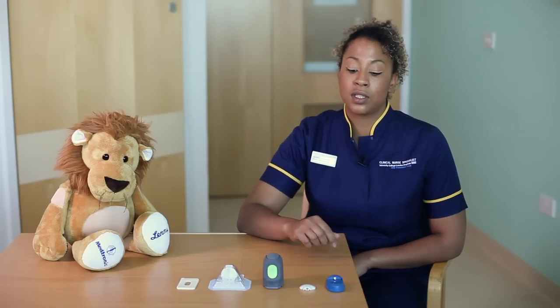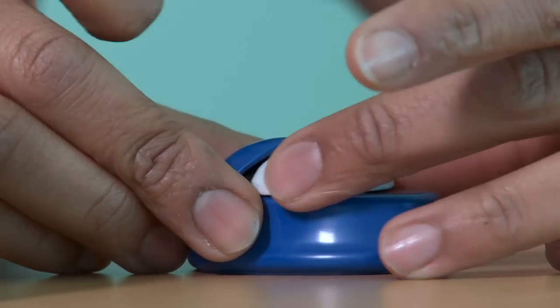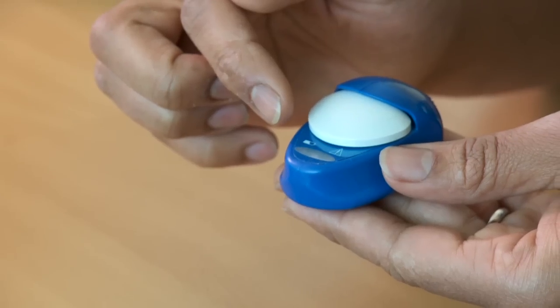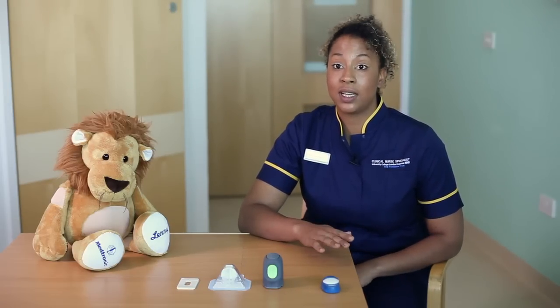The first thing you're going to do about an hour beforehand is place the Mini-Link onto the charger. You'll see a green light flashing — that means it's charging. Just put that to one side, and when it stops flashing that means it's ready and fully charged.